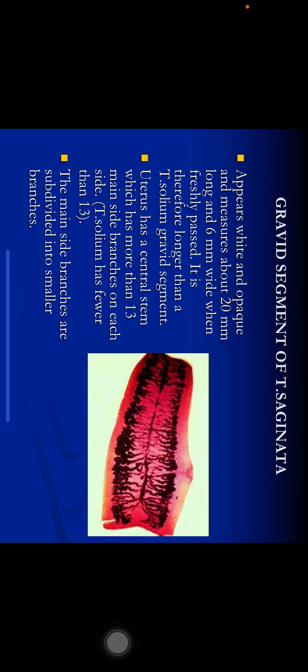Parasitology, cestode slides. Gravid segment of Taenia saginata. The gravid segment of Taenia saginata appears white and opaque and measures about 20 millimeters long and 6 millimeters wide. It is therefore longer than the Taenia solium gravid segment.